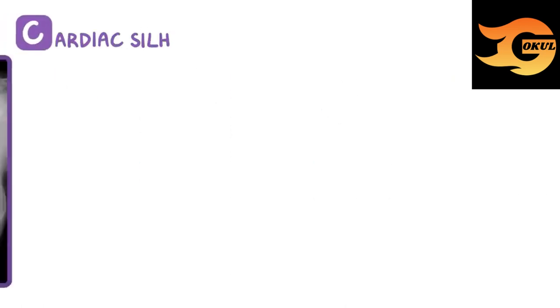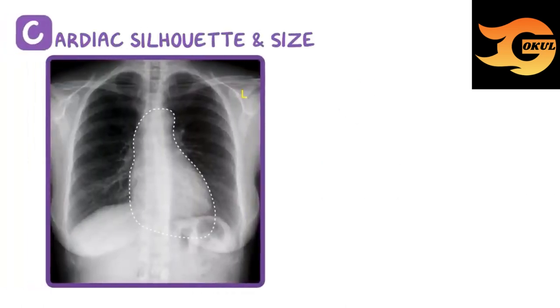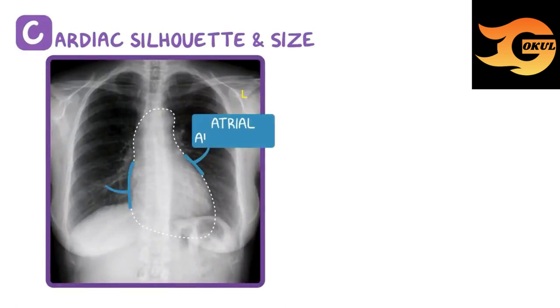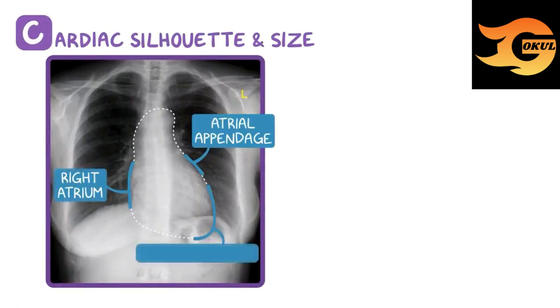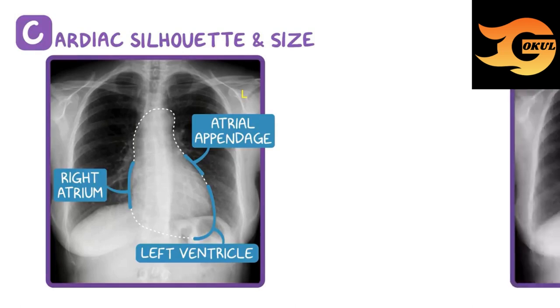C is for cardiac silhouette and size. This is the cardiac silhouette, and there's an atrial appendage, the right atrium, and the left ventricle. Remember, in chest x-rays we define features relative to the patient, so the right atrium is on the left side of this x-ray, and the left ventricle is on the right side.